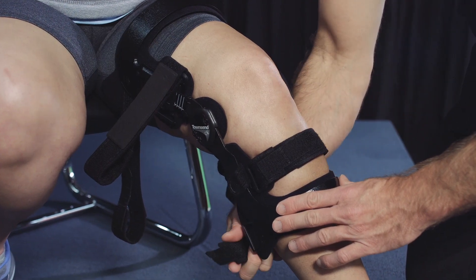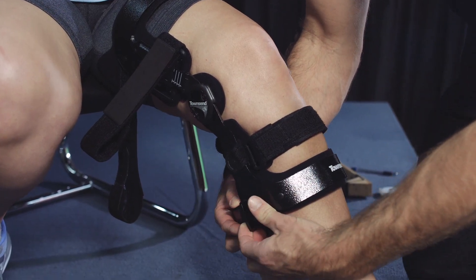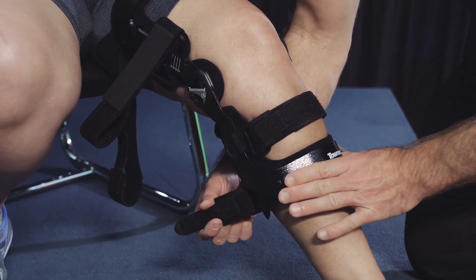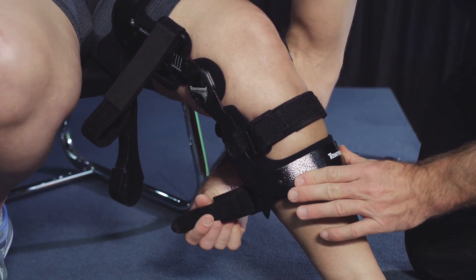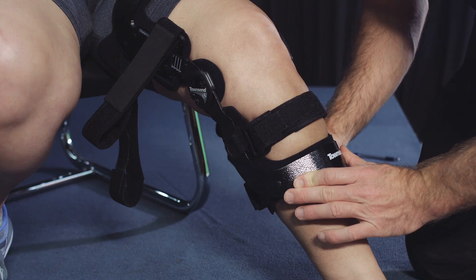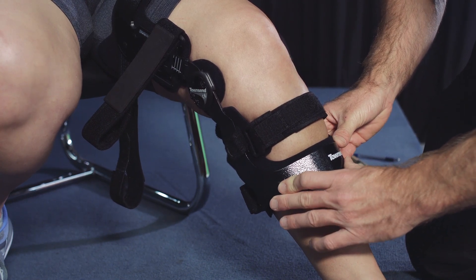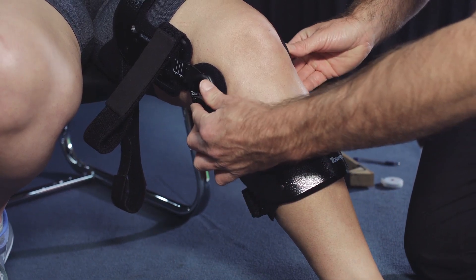Tighten the distal calf strap to secure the lower band against the tibia. This band is specifically designed to intimately fit against the flatter medial aspect of the tibia and the rounder lateral aspect of the shin to prevent brace rotation while the patient is active.